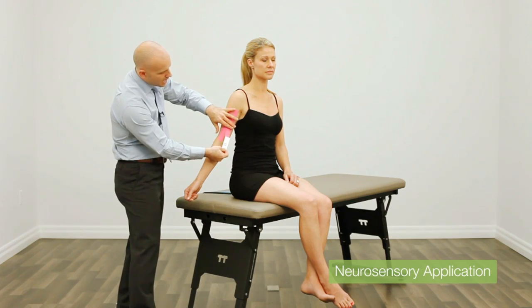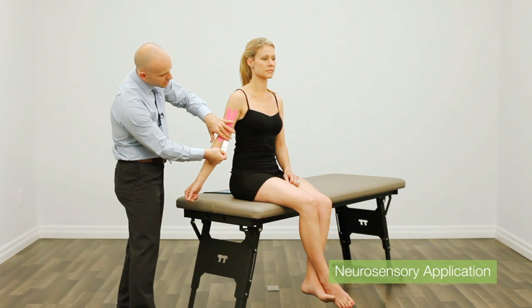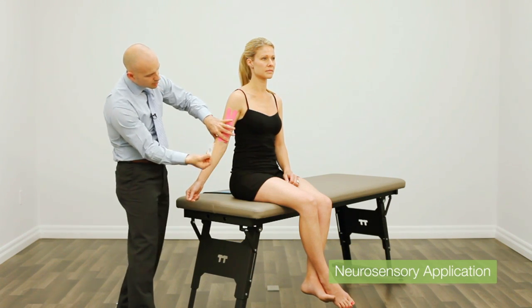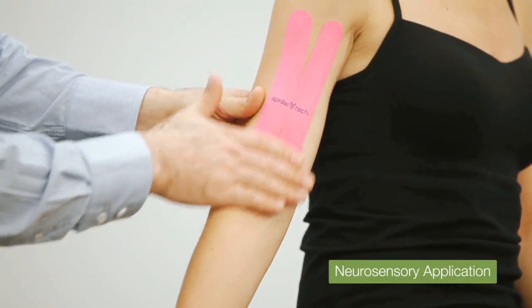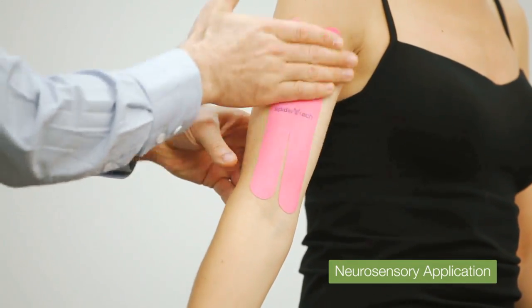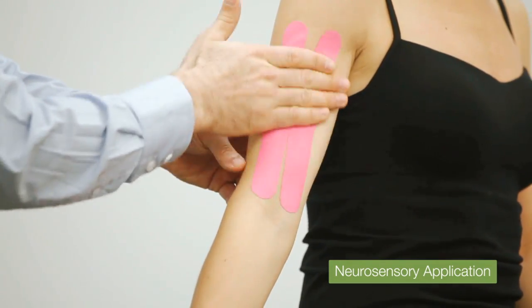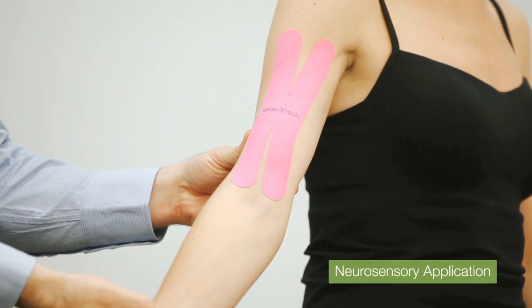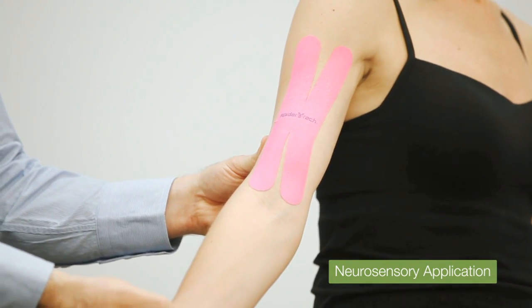Peel the backing off, lay the tape down in contact with the skin, wait till about 90% is applied, and then rub over top of the tape to activate the glue. That would be an example of a neurosensory application.